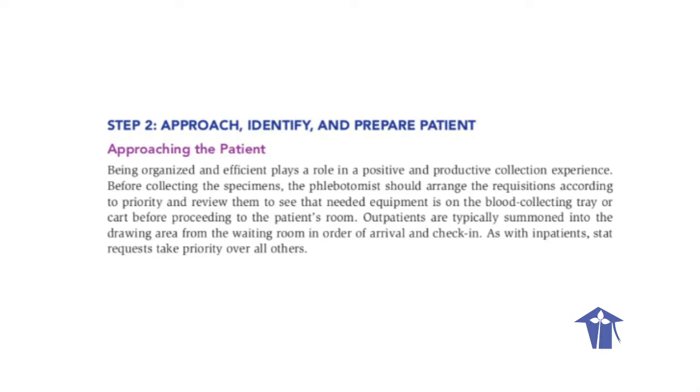Approaching the patient. Being organized and efficient plays a role in a positive and productive collection experience. Before collecting the specimens, the phlebotomist should arrange the requisitions according to priority and review them to see that needed equipment is on the blood collecting tray or cart before proceeding to the patient's room. Outpatients are typically summoned into the drawing room from the waiting room in order of arrival and check-in. As with inpatients, STAT requests take priority over all others.